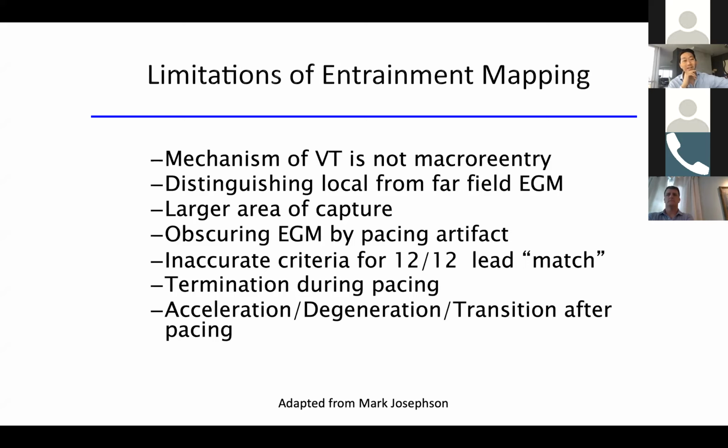And if you've read anything by Waldo, you know there's 3 criteria. We almost never satisfy all 3. But you need to show progressive fusion, constant fusion, and then at cessation of pacing, the wavefront needs to change with the local electrograms you're recording. So you cannot assume that overdrive pacing means it's reentrant. We all know that, but that needs to be emphasized.